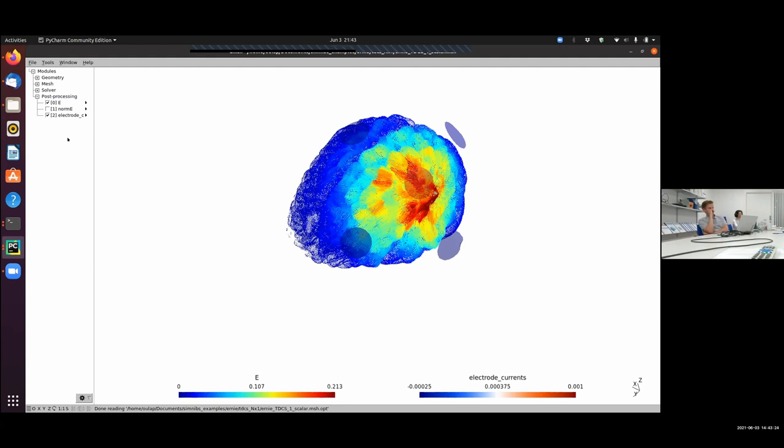What that means is that with a little bit of luck, you should be able to use exactly those coordinates as input coordinates for your neural navigation software, because normally neural navigation software also doesn't change the spatial information of the T1, but saves the coil coordinates in that coordinate system. So just use headreco and see whether you can simply use those coordinates. If you get stuck, write us on the help list and provide some information on which neural navigation system you're using, and then we try to help you further, as long as we don't have it supported more systematically, which we plan to do, but it will still take a bit of time.